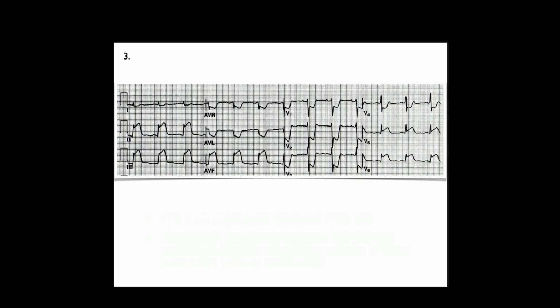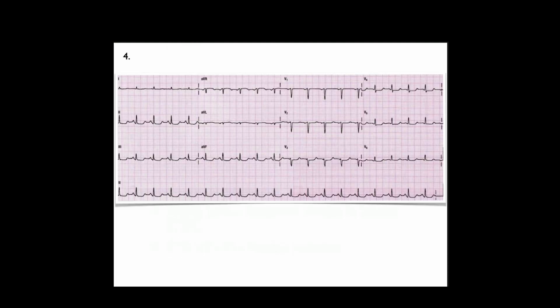Okay, Cohen, you're next, number 3. Oh, you lucked out. Depression in the high lateral, and I think that's due to reciprocal changes from the inferior. There's ST depression in the septal anterior, and that's possibly due to a posterior STEMI. Perfect.